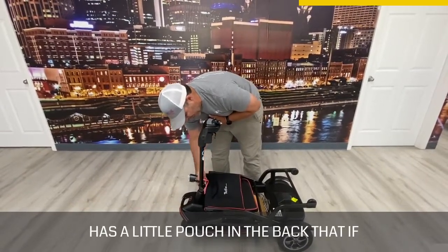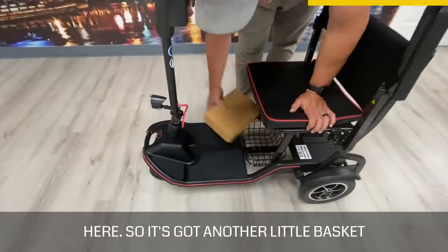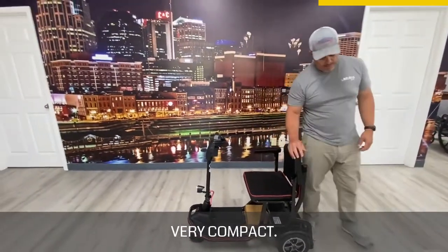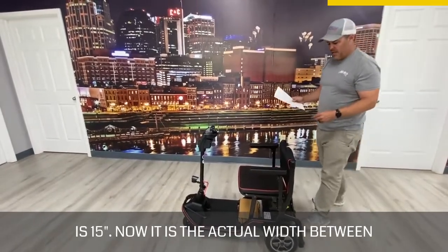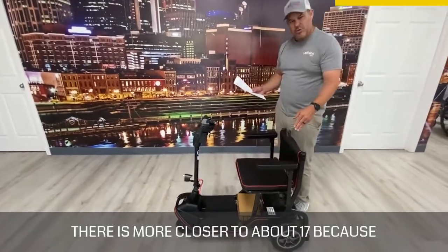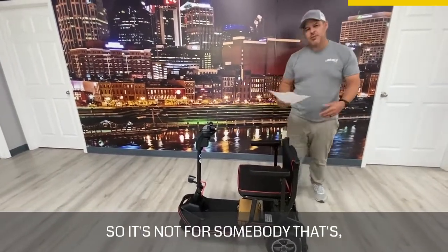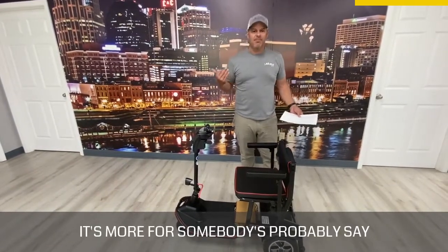It has a little pouch in the back where you can put your charger or something in there. We also have the charger sitting underneath here — there's another little basket in there too. Very user-friendly and very compact. The seat width is 15 inches; the actual width between the arms is closer to about 17 inches because of the way the arms sit, but the seat itself is 15 inches wide and 14 inches deep. So it's more suited for somebody that's about 5'8 or under.